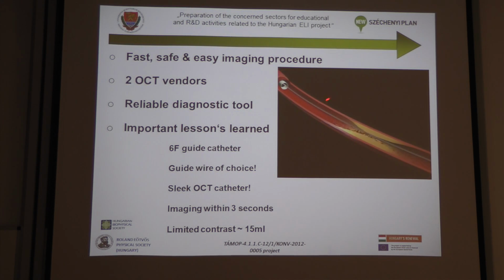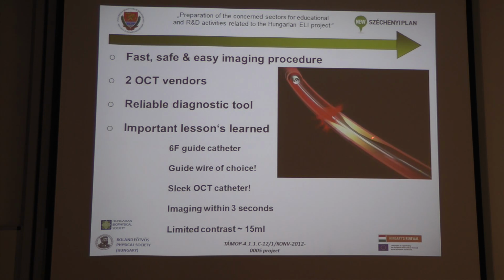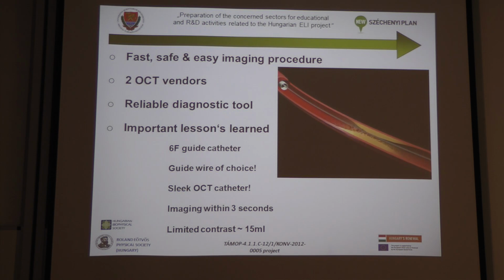So this is an animation with the erythrocytes, with the wire already placed across this particular stenosis, this lesion, we are interested in getting the details on. So this is this plaque full of atheroma or any kind of other tissue. So this is a loop. You can see that the procedure is as fast as this.